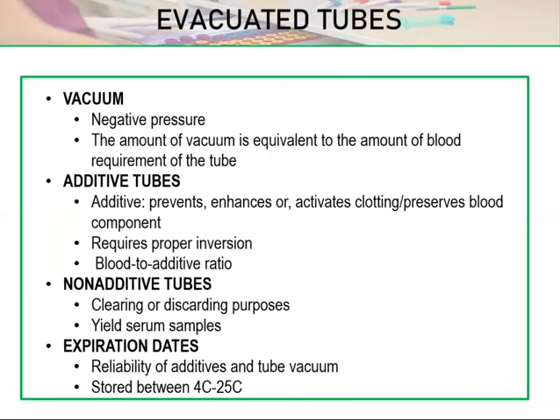I know some of you kept your first blood extracted in the laboratory. Try to observe it if you placed it inside an additive tube. Even after we are done with our PMLS2, try to check if your blood sample is still in its liquid state. Normally, the process that blood undergoes once it is removed from the body is that it will undergo clotting or coagulation.